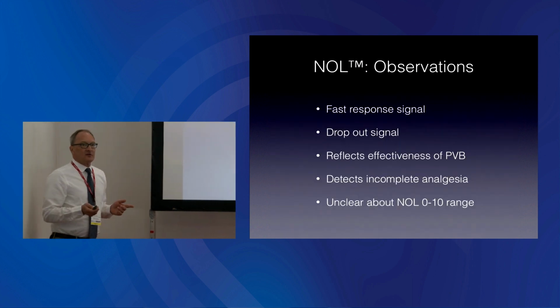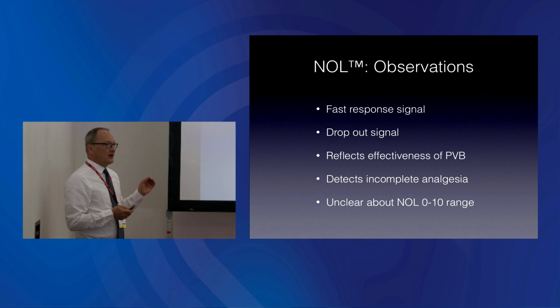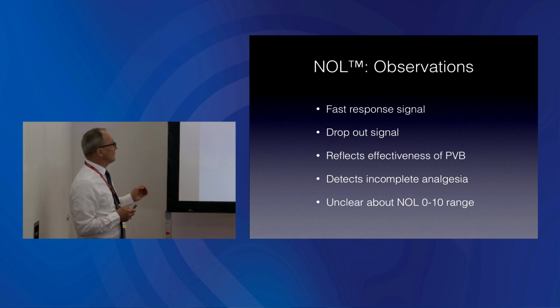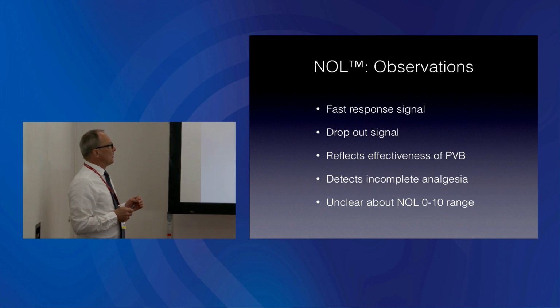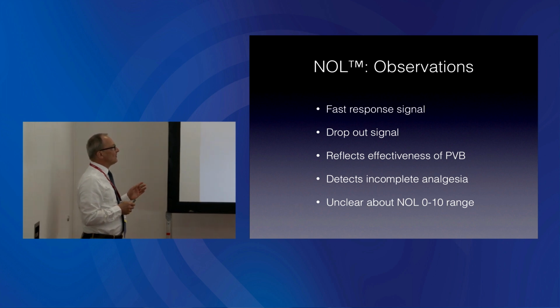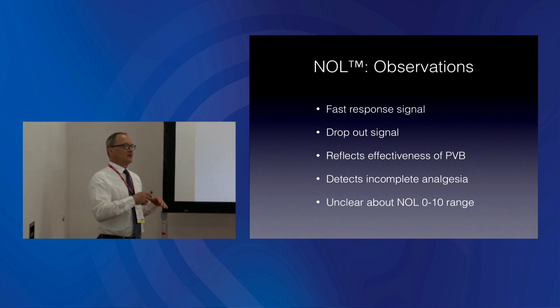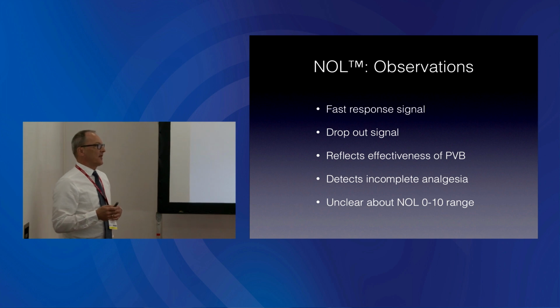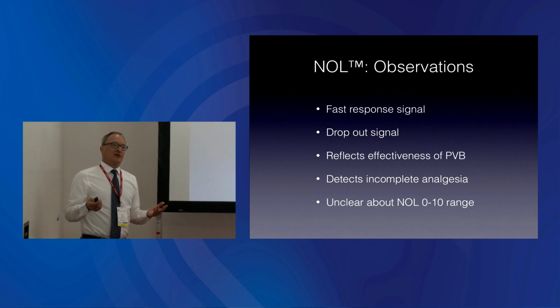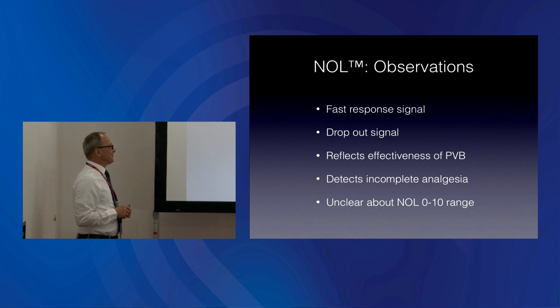So my observations so far with the technique: it is very, very rapid. It is a fast response signal. We do have, I must say, the odd dropout signal issues, especially if the patient is moving in the transition phases of induction and recovery. That may be just me using it the wrong way, I don't know.